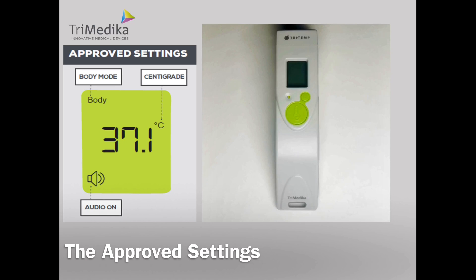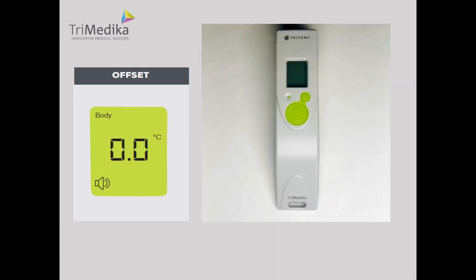The approved settings are as follows: Celsius, audio on, body, and the offset should be set at 0.0.